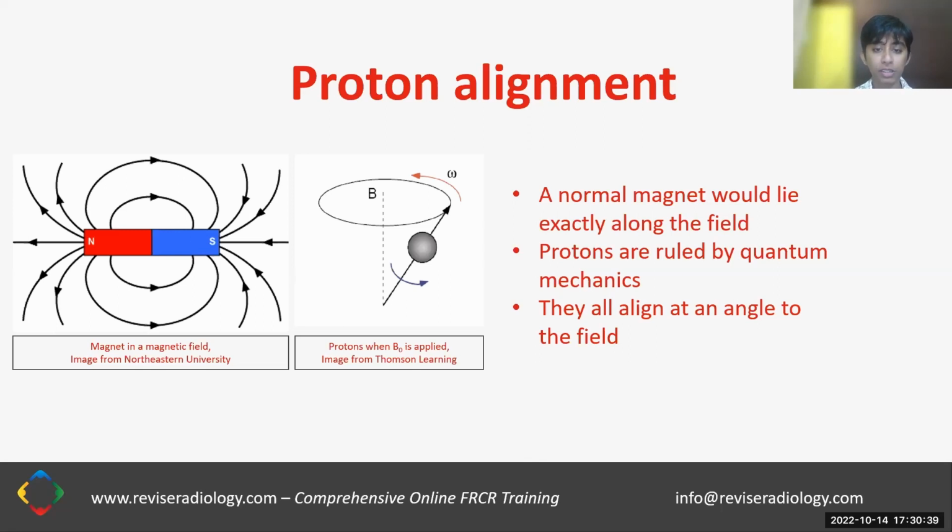when the proton is spinning. So the proton is spinning on its own axis like a tiny little planet. The spin angular momentum points along the direction of the axis. If you imagine the proton spinning around an axis, the spin angular momentum points in that direction.